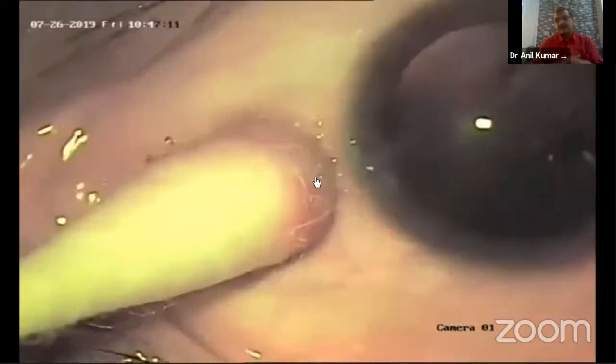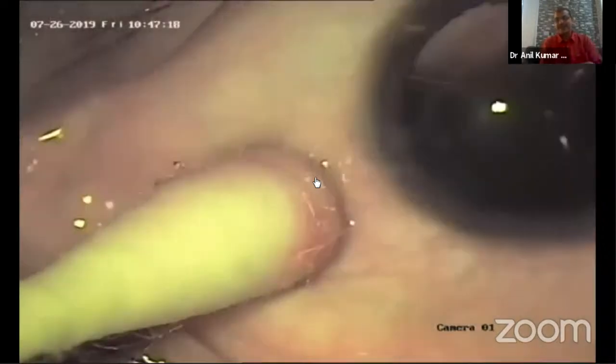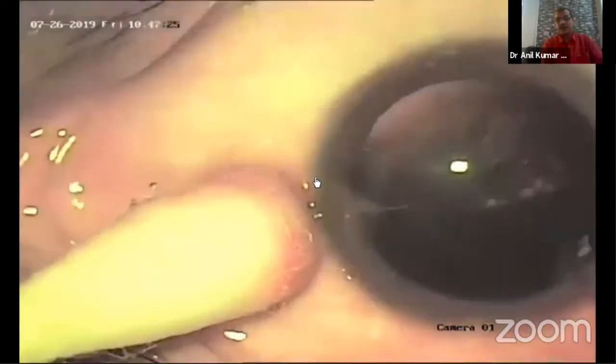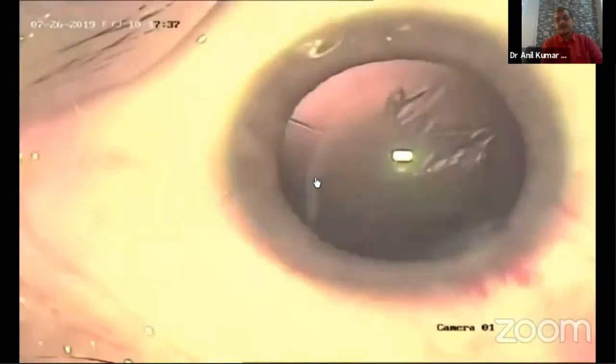Then the rest of the phaco procedure, all our seniors are better surgeons than me, I suppose, so it's not a very big deal. But here precision in taking the incision and in doing the CCC matters. The main port's entry should come in between the two lines. If you are slightly off, there are chances of wound dehiscence. I remember in a few cases I have put sutures also to make it secure and to keep the anterior chamber well formed.